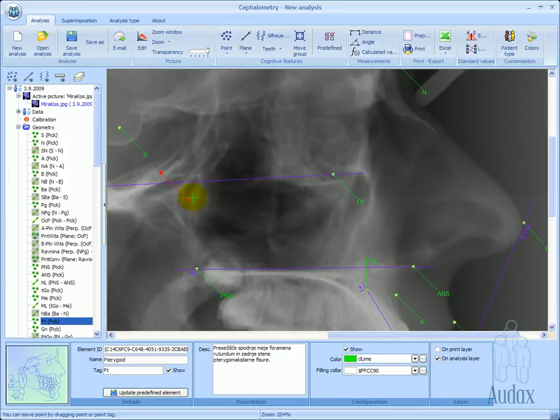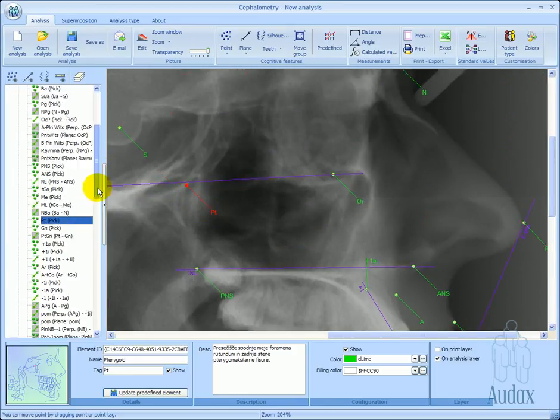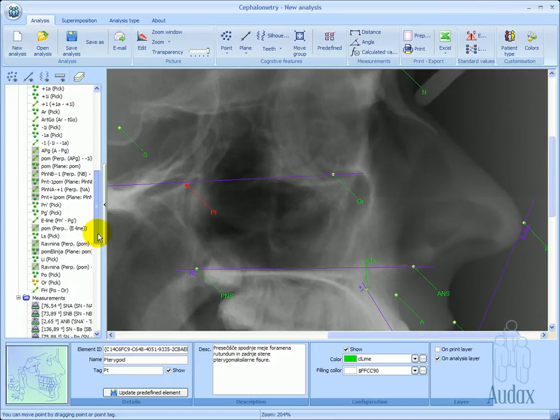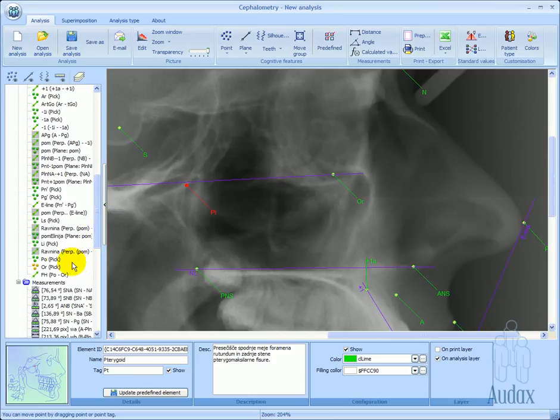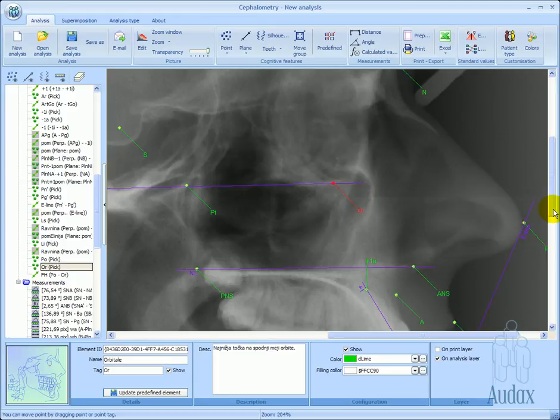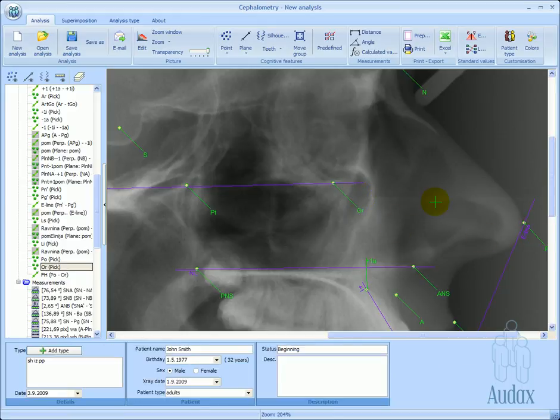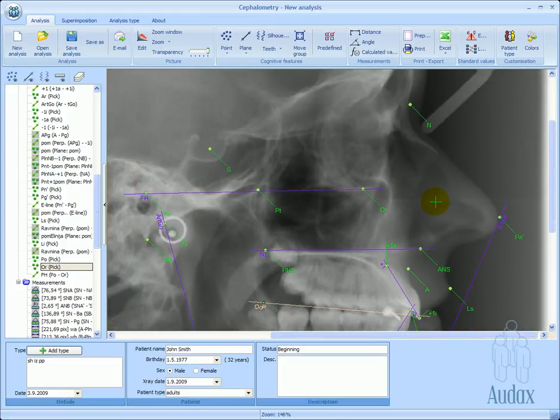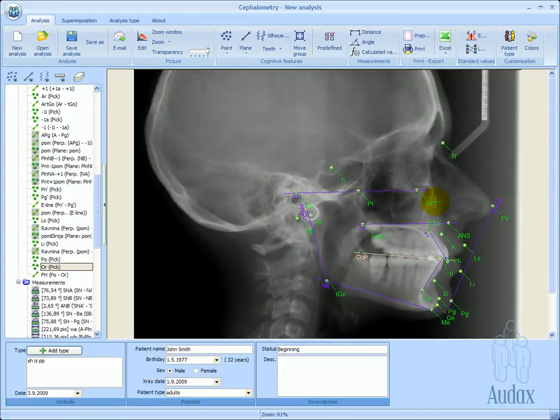In our case, we see the occlusal plane, the pterygomaxillary fissure, and also the orbitale point as identified and able to be adjusted.